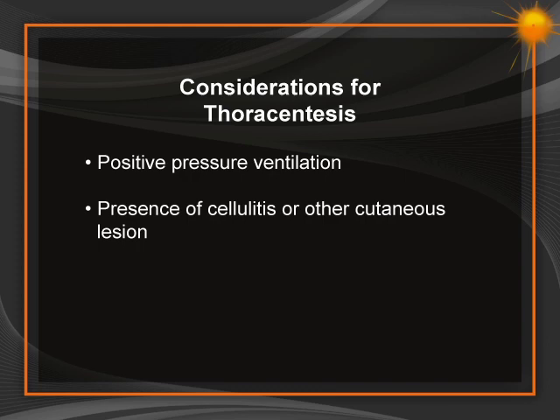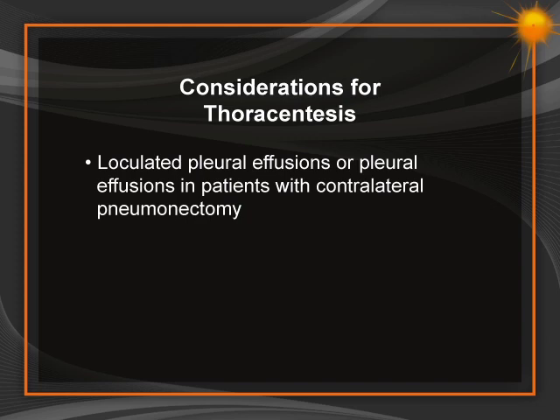The presence of cellulitis or other cutaneous lesion, which should be avoided to reduce risk of introducing infection into the pleura. Presence of loculated pleural effusions or pleural effusions in patients with prior surgery on the ipsilateral or contralateral chest, as mentioned earlier.